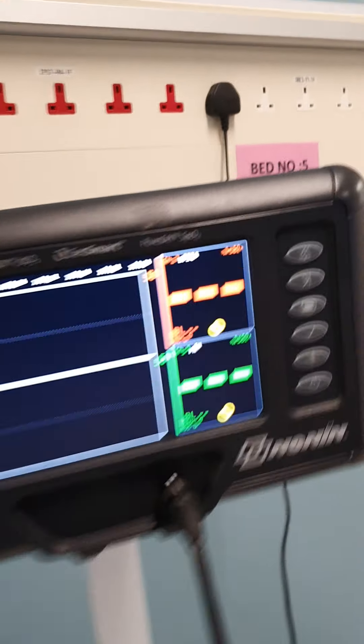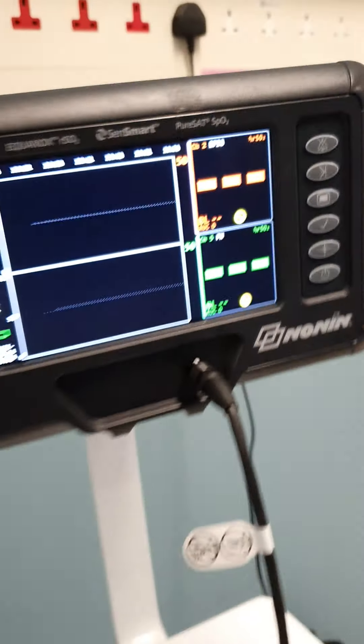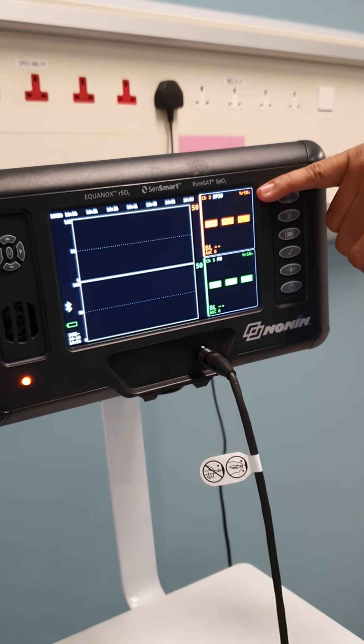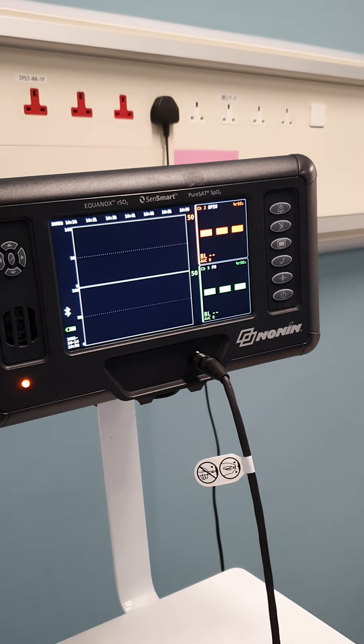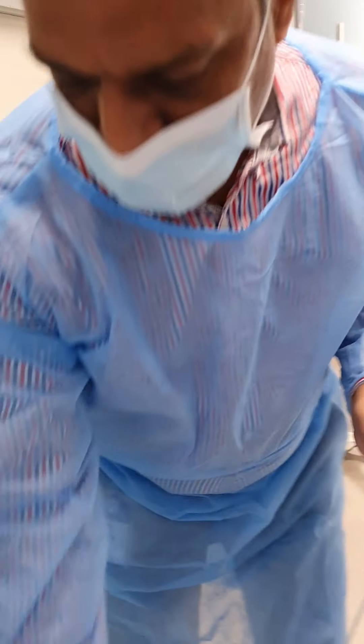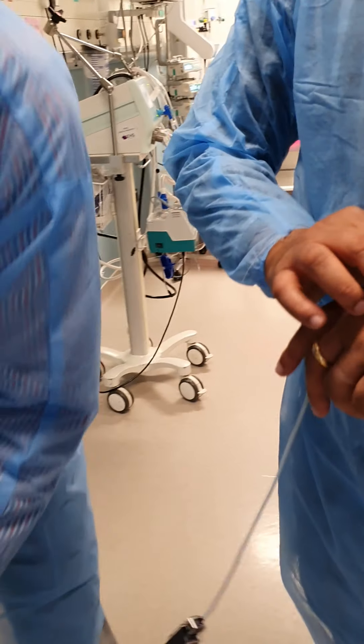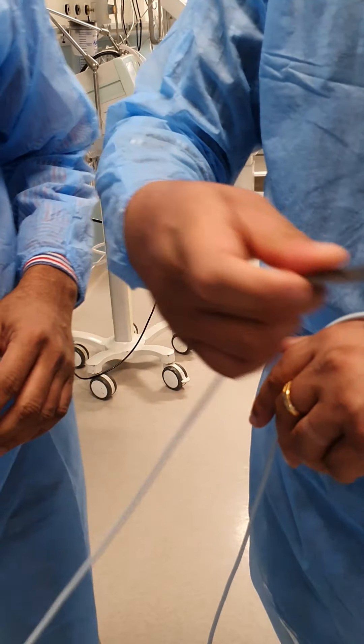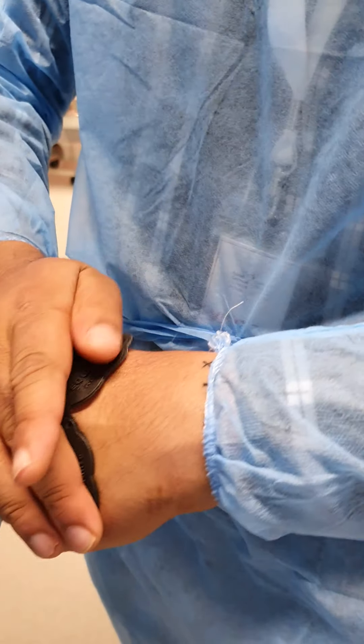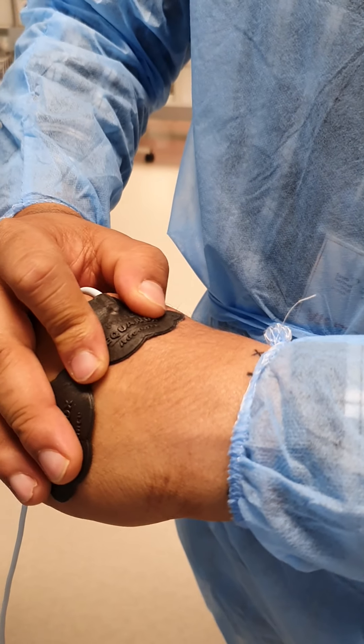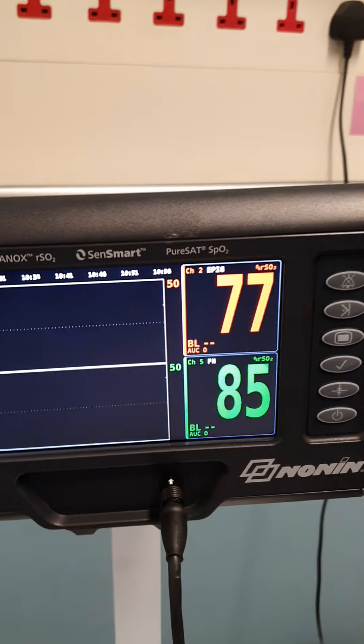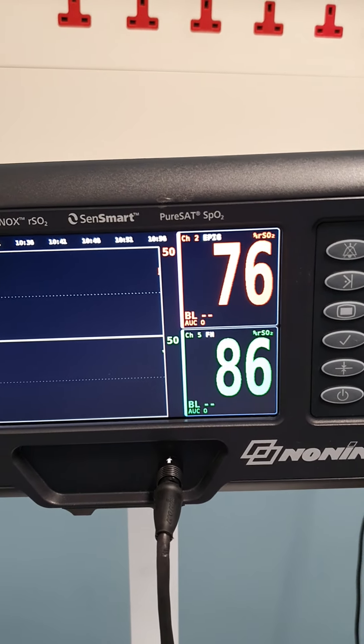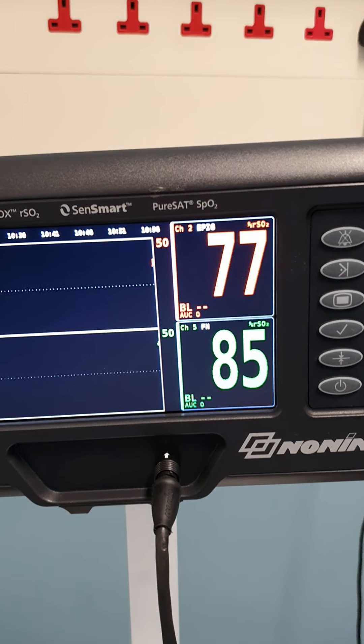Now you can see over here, this is the main screen. You can see your green is showing forehead and it's showing you epigastric whatever we have defined. Can you be my patient for the time being? You see the moment we have connected, you have the readings over here. Two channels are there. So supposing this is somatic and this is cerebral.